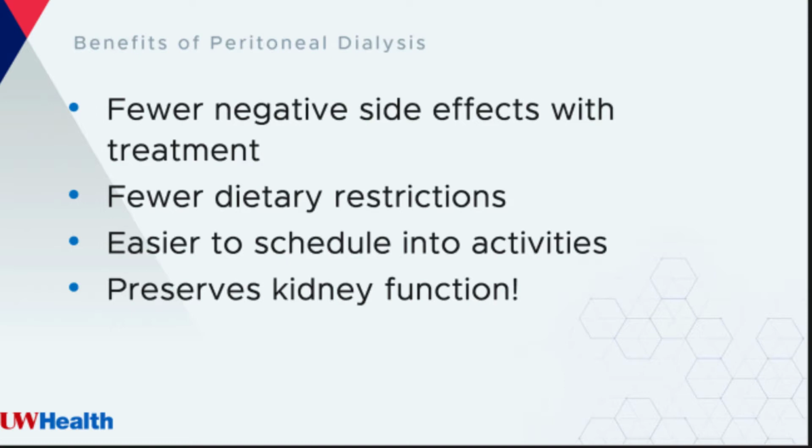Peritoneal dialysis acts more like a natural kidney, exchanging fluids in the body compartments and removing those wastes over a long period of time on a more regular basis than what a patient gets with hemodialysis. Hemodialysis is only 3 times a week and is only for 3 to 4 hours. That would be like having kidneys that function for those periods of time. So it's much harder on the body to have it done quickly as opposed to just gently over time.